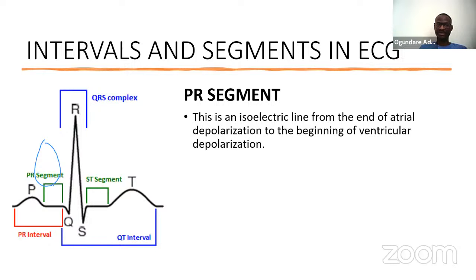the clinical relevance of the PR segment is enormous. As a matter of fact, it's one of the key features we use to diagnose pericarditis.